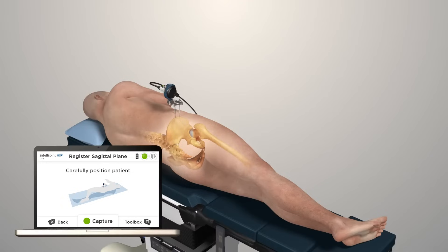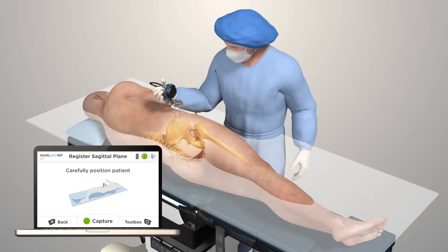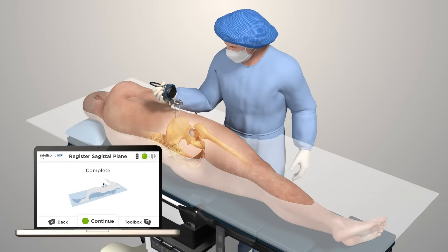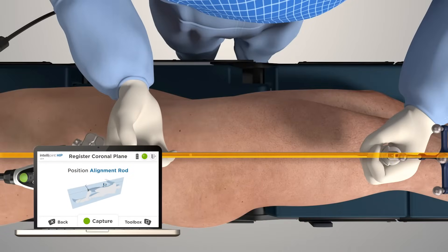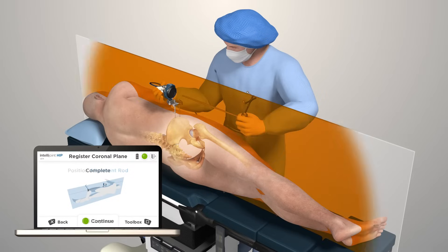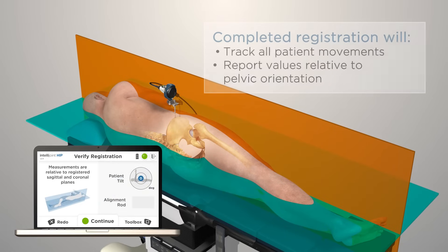A simple registration is quickly completed following accurate positioning of the patient, and prior to performing the primary incision. Ensure proper patient positioning and register the horizontal plane by pressing the green button on the camera. Use the alignment rod and tracker to register the coronal plane of the pelvis. You may adjust for pelvic tilt at this time. Registration is now complete. IntelliJoint HIP will now track any patient movement and report values relative to the current orientation of the pelvis.